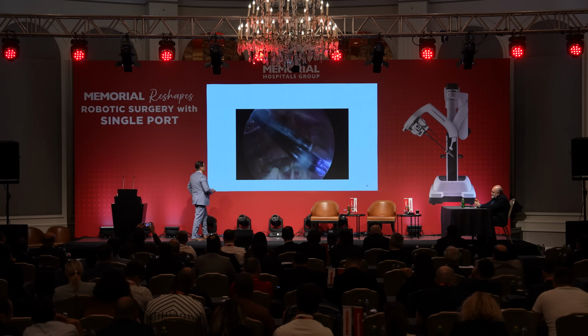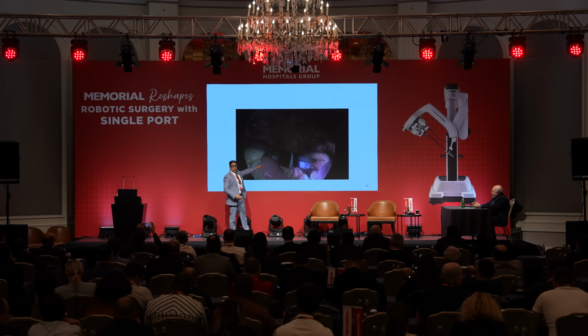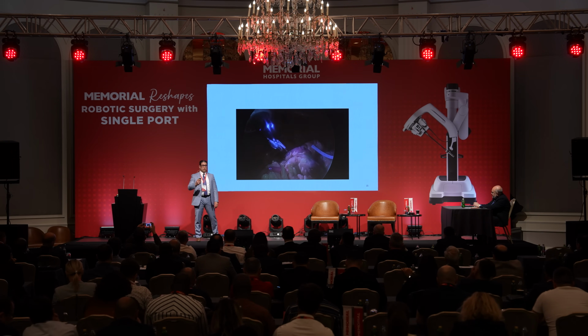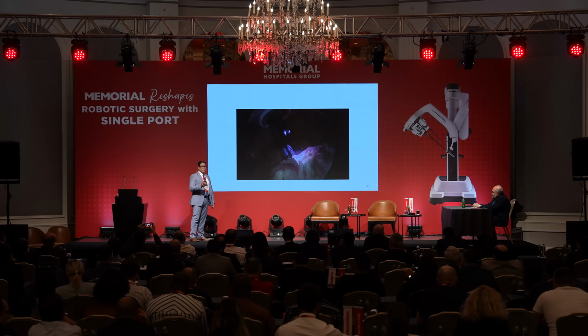Now, you see only what's in front of the camera, so you can cause harm by this. So you need to be aware that something like this you may injure, most likely not. But if you don't see the tips, and the tips pull a mesentery, all you're going to see 5 minutes later is a pool of blood in your abdomen. So be careful, because it happened before.